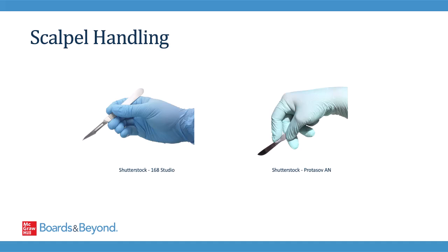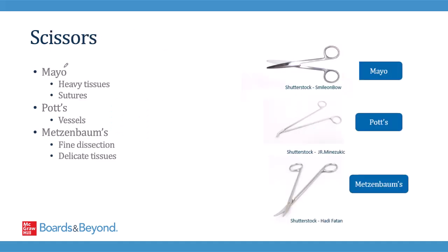Scissors are commonly used in the operating room. The Mayo scissors, like the ones you see on the screen here, are used to cut through heavy tissues as well as cut sutures — that's why they're also known as suture scissors. Pot scissors are often used in vascular surgery to make cuts in blood vessels, and the angled nature of the blades allows you to do that better. Metzenbaum scissors have a longer handle-to-blade ratio, and so they're often used for fine dissection in difficult-to-reach areas in order to help expose delicate tissues.